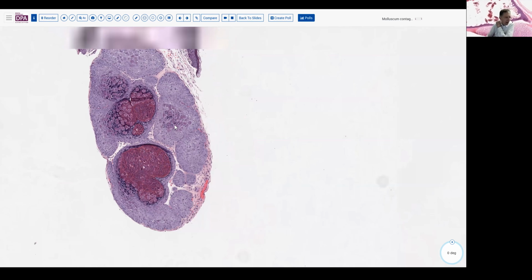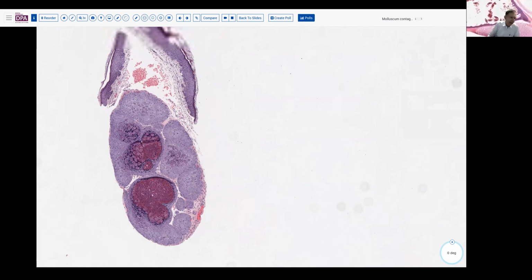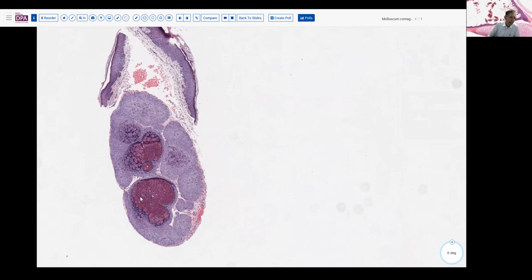And that, I think, perhaps is an indication that there are circumstances where this is not a surgical disease necessarily. It can occasionally resolve spontaneously as essentially the body responds by proliferating and getting the infected cells outside the body and expelling them that way. But this is, of course, the stage at which it would be infectious to other individuals when these virally infected cells are present and these inclusions are being extruded onto the skin surface.